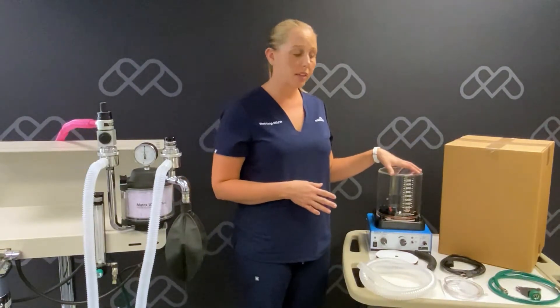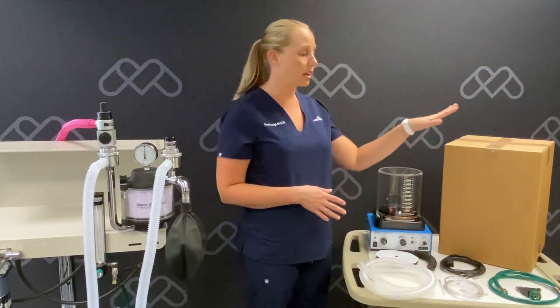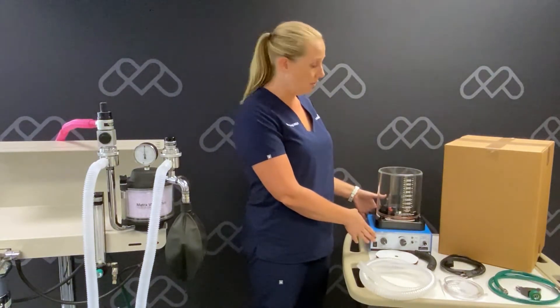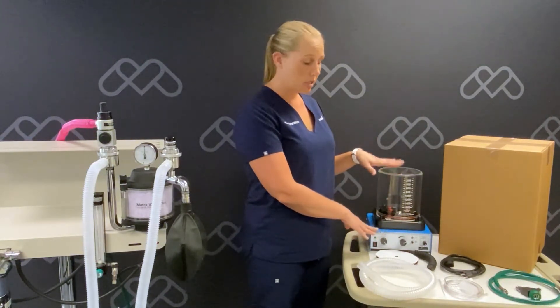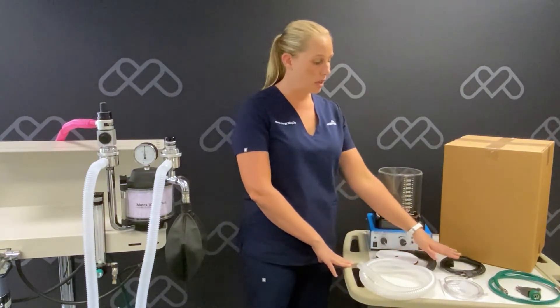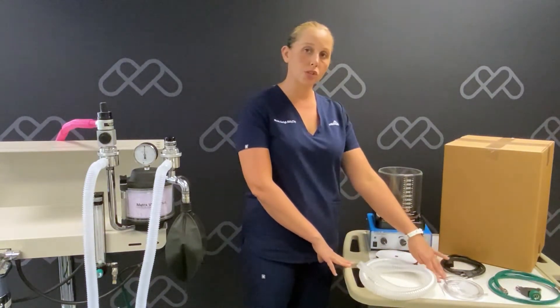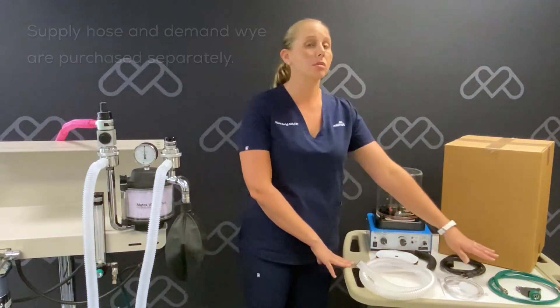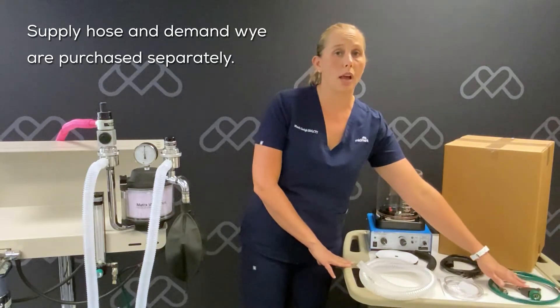We'll begin by getting the ventilator and all of its components unpacked from the cardboard box. We'll have the ventilator itself, the bellows housing, the bellows, our drive gas tube, power cord, pressure sampling T, and the corrugated tubing. You will also need a supply hose and a demand Y.